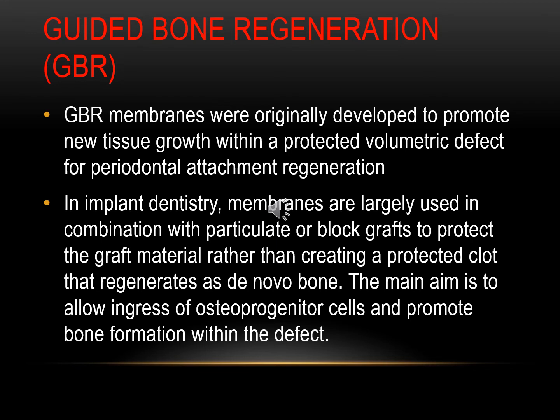Guided bone regeneration, or GBR, means prevention of soft tissue formation inside the bony defect during the duration of bone formation. The membrane also has another advantage, which is to fix the bone graft and prevent the bone graft from movement during the healing time.